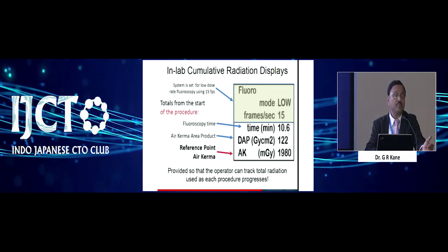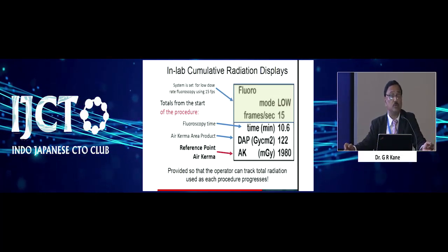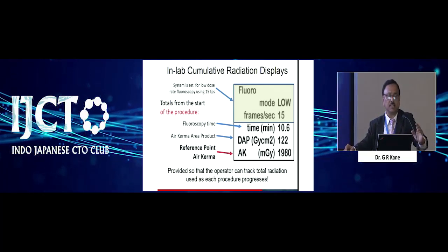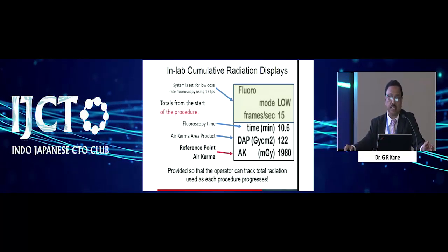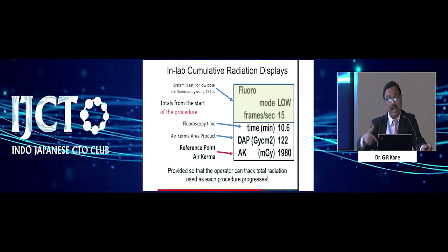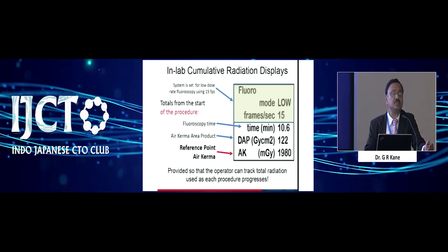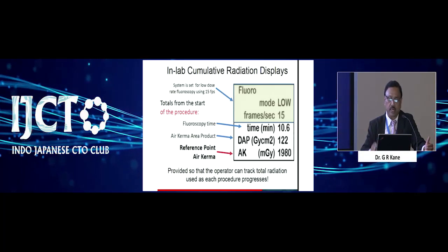This should be taken into account. Let me be very frank with you, though I also do CTOs, I have still not bothered to look at all this. We look at it maybe sometimes just when I have to give a talk or something happens, and then we say, let's look at it. But internationally, if I am not mistaken, every case has to be documented, entered into a logbook, and discussed in your cath meetings. Only that is the way you can improve. So what is happening? Where are you making a mistake? Where can you improve? All those things are important. So you can get your fluoro time and you can get the gray exposure of the patient.